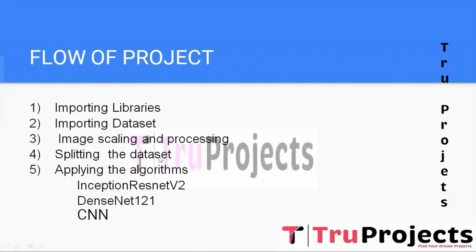And the fourth step is splitting the dataset. The dataset is split into two subsets, a training set and a testing set. The training set is used to train the deep learning model, while the testing set is kept separate for evaluation. This separation ensures that the model performance is assessed on unseen data. And the fifth one is applying the algorithm. Three different deep learning algorithms, Inception ResNet V2, DenseNet 121, and CNN, are implemented.